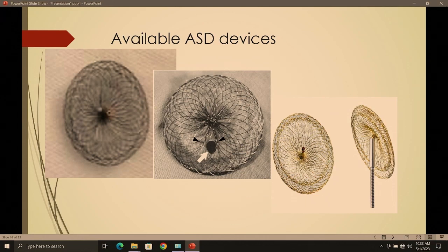The available devices should be known, because this is an Amplatzer. The sizes start from 4 to 40. These are other Cera devices or Occlutech Figulla Flex. These sizes are also 4 to 40, but customized sizes are also available.